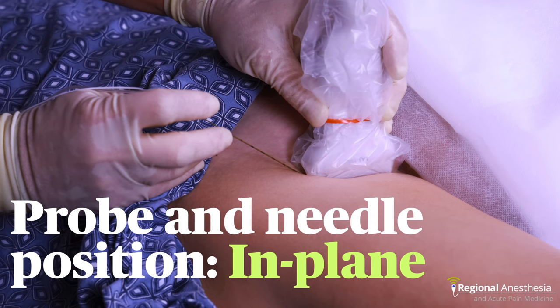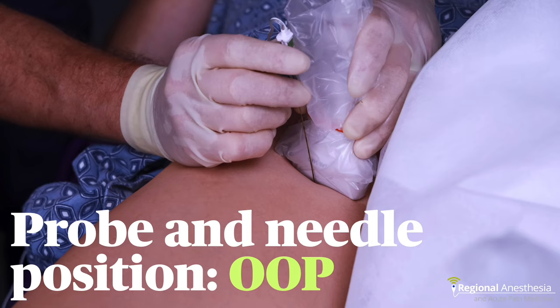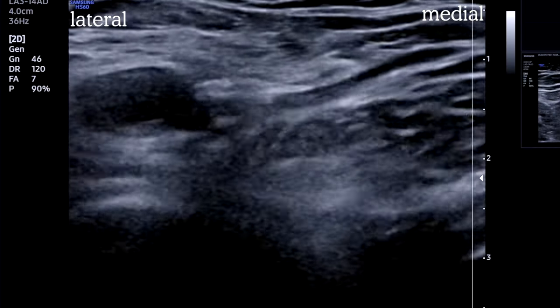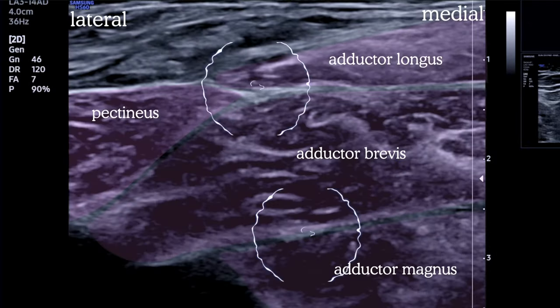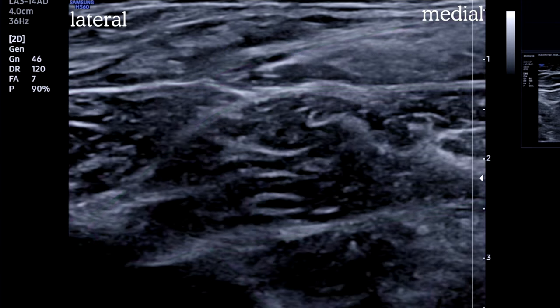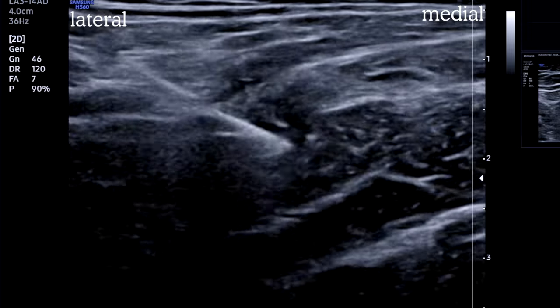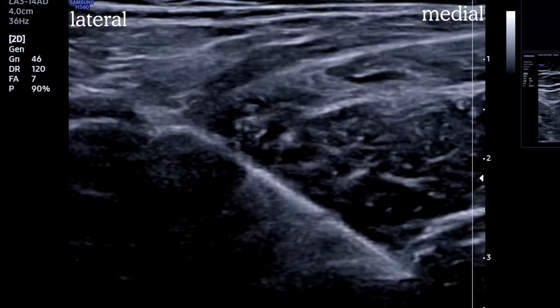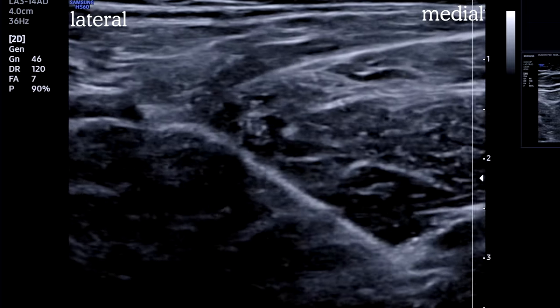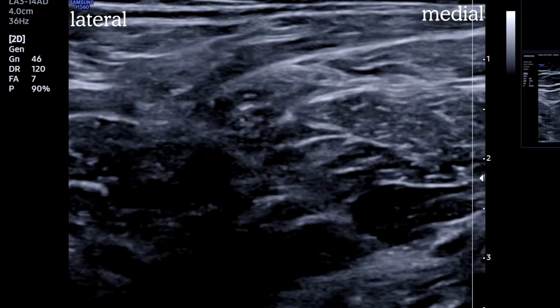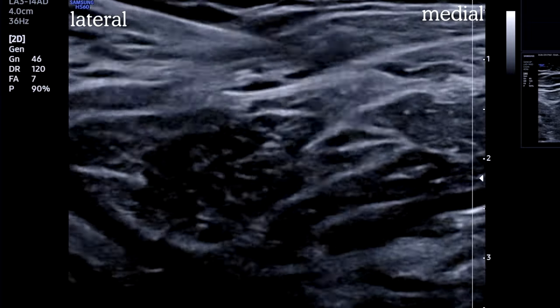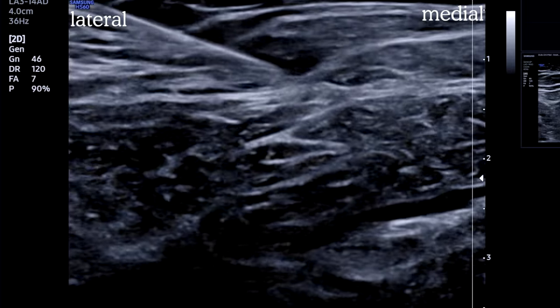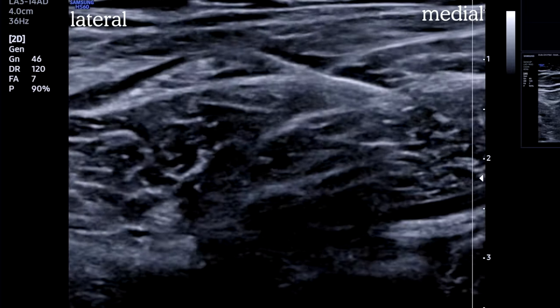We'll position the patient supine with the lower limb frog-legged to allow us to get the probe into the medial groin. The needle will advance from the lateral aspect in most cases, though you can do this out of plane as well. We start with the femoral artery and vein and then slide the probe medially. A little tilting back and forth helps us find the three adductors, pectineus, as well as the two nerves. Taking care not to hit the femoral vein, the needle enters from lateral and is advanced to the posterior branch first so the injectate won't distort the visualization of the other nerve. You can see the plane opening up nicely here with five mils of local. We'll then withdraw and reorient on a more shallow glide path aiming at the anterior branch, advance, and deposit another five mils there.